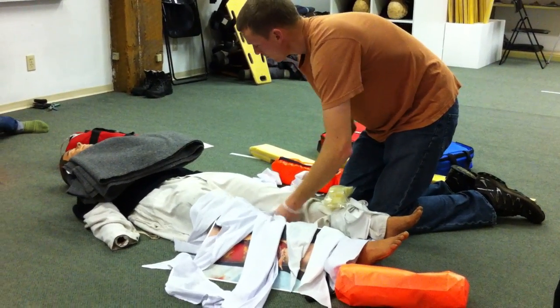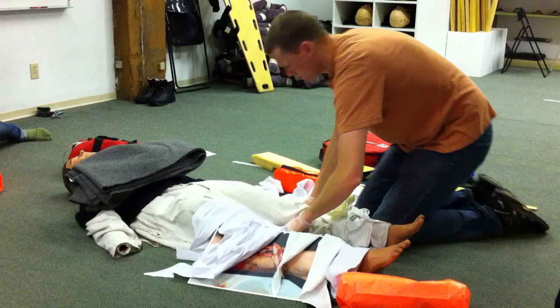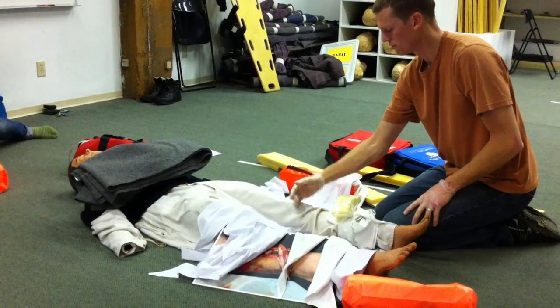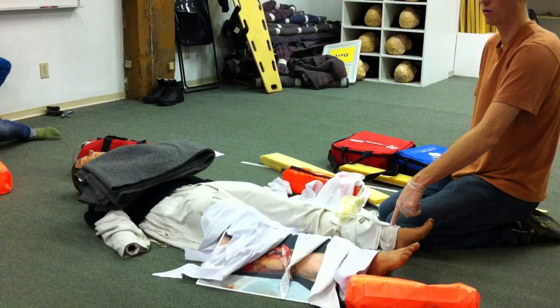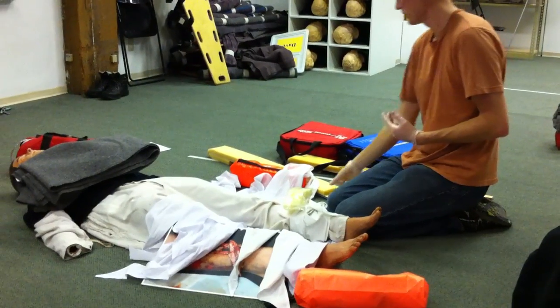You want one above and below the injury. So I think of it, I want two on the long bones, and I want one for each of the joints. Two on each one, two, one bone. Three, yeah. Four, five, six. So that's my goal. Okay. So probably about this time we're going to be doing an ABC reassessment, okay, and making sure all that's okay.